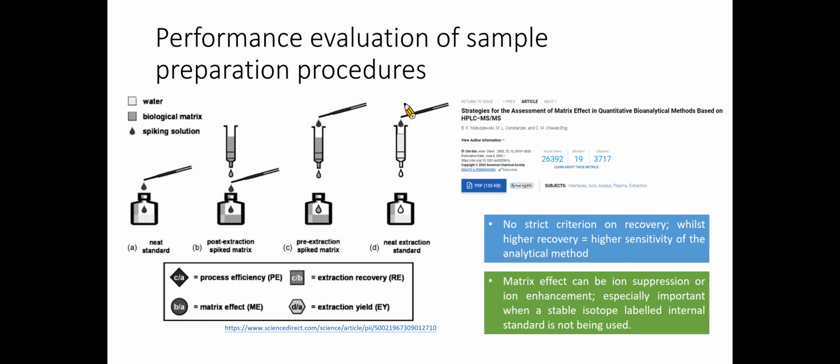Since generic procedures are often used in multi-analyte determination, a low extraction yield could lead to a recovery misevaluation. Therefore, extraction yield, as determined by the peak area ratios of neat extraction standard and neat standard, can help to clarify whether the low extraction recovery results from the interfering compounds or the SPE itself.